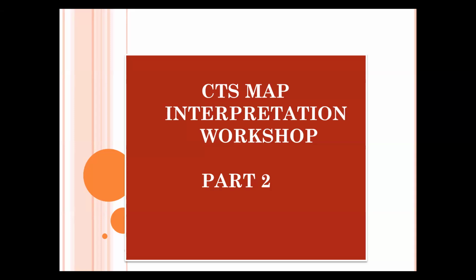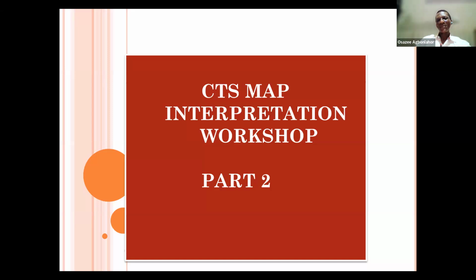I agree with the presenter, Dr. Gochi and our NC. I think we should have part 2 for another day. Absolutely, I can't agree less with what we have said. The truth be told, this is really the main thing. The first one was just a scratch on the surface. There's a lot to talk about in this part 2.